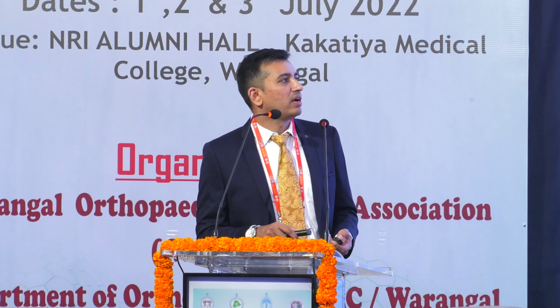So first is the Gilula's arc. These are three concentric lines parallel to each other, which are drawn parallelly, and when there is a lunate dislocation, these lines are broken, and again in scapholunate dislocation, these lines are broken. In detail about that.